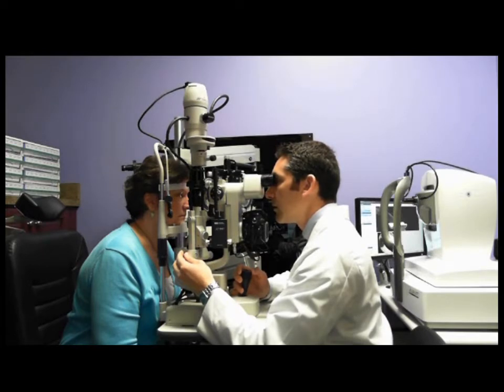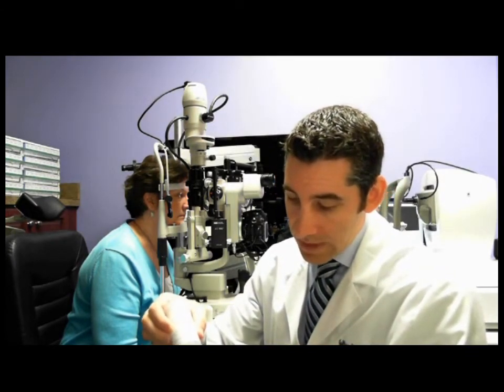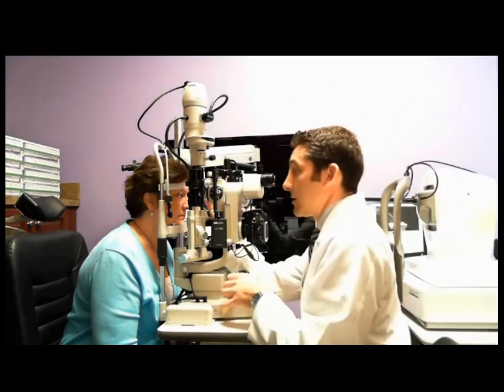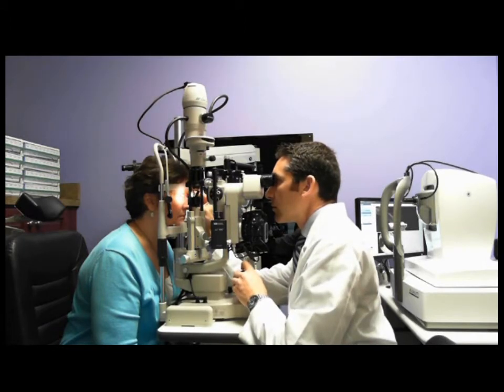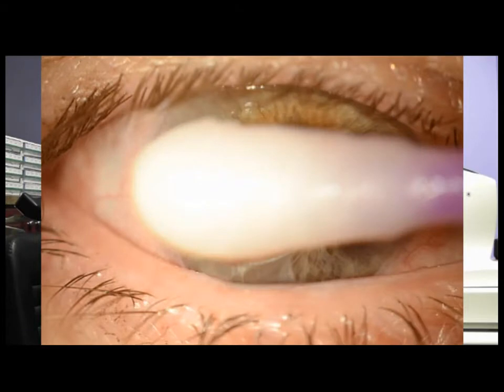Okay, the next thing I want to inspect is I want to get an idea of the magnitude of the vault. Actually, you know what, I will show you a trick here before we get into that. If you do have the situation where the lenses are wetting poorly, one trick that you can use is you can take a Q-tip moistened just with regular saline, or gas perm solution for that matter. And you can literally squeegee the front surface of the lens. And that just restores a good front surface for you to work with when you're evaluating the lenses. And you can see the difference here.